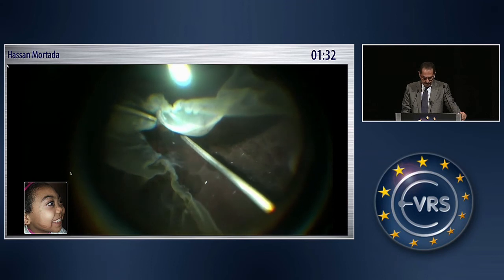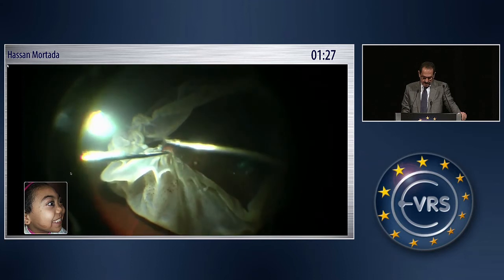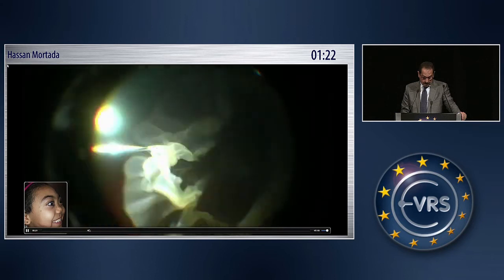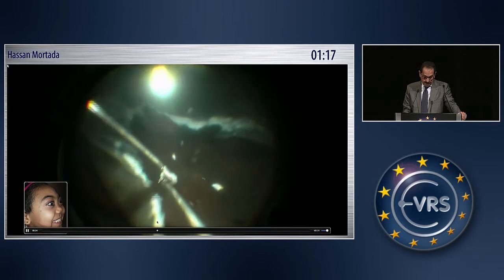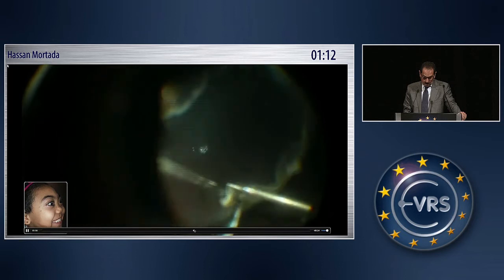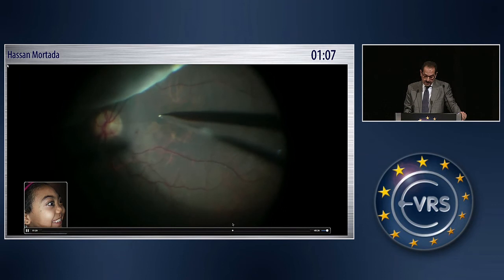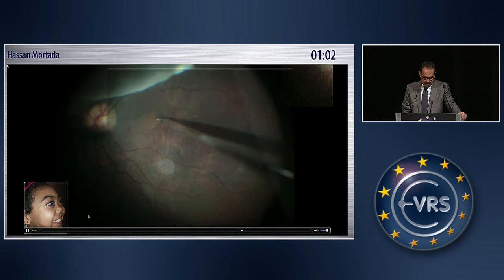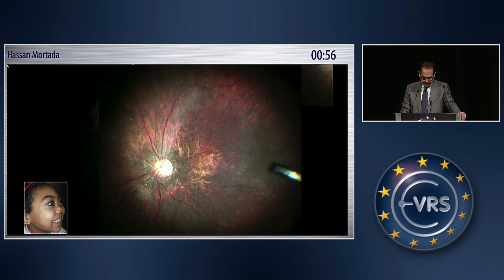This is a case of Stickler syndrome — a severe case with a 360-degree giant retinal break — where we tried to open the funnel, then diathermy was applied, and we completed the flap. We removed the PFCL, injected the dye, and removed the ILM. This is the picture at the time of silicone oil removal: the retina is completely attached with no proliferation.